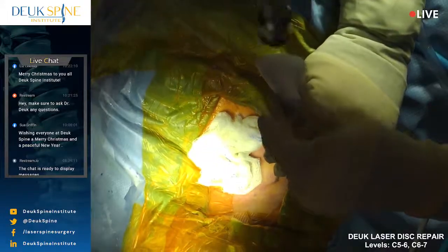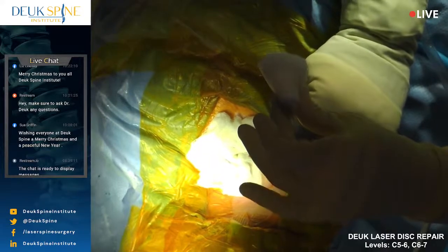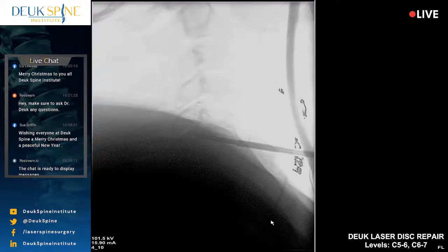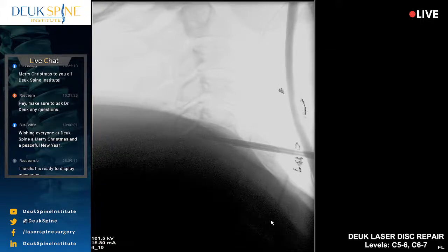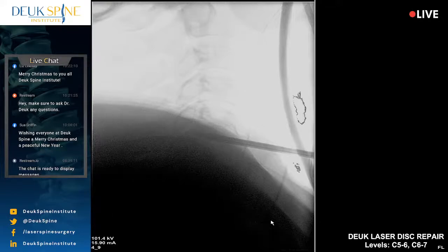All right, Luis, last one. You ready? So we're going to advance the tube over the dilator. It's just making the tube a little fatter, basically, or the dilator a little fatter. Again, it's just little increments. You're working over the spinal cord, so we want to make sure that we don't have the dilator or the tube going into the spinal cord. Are you pulsing? Good.